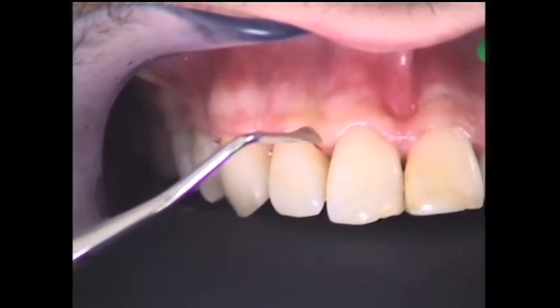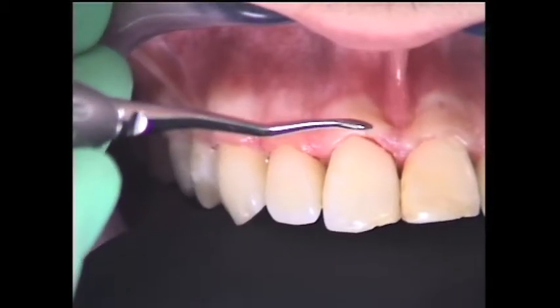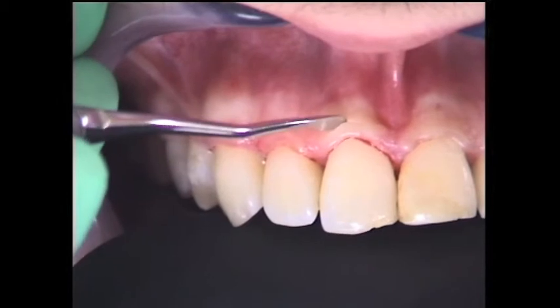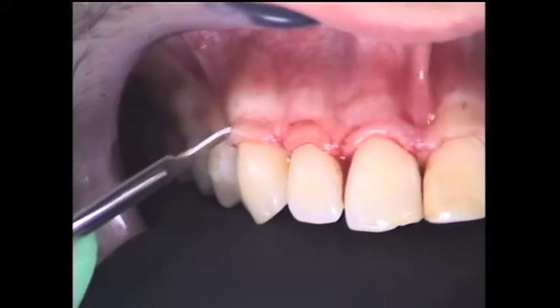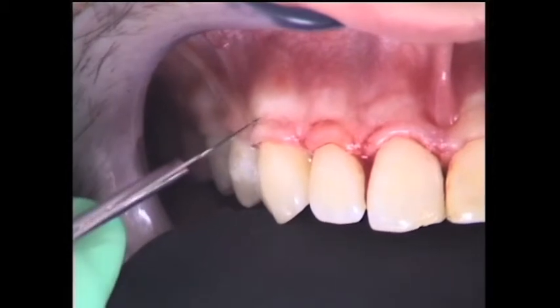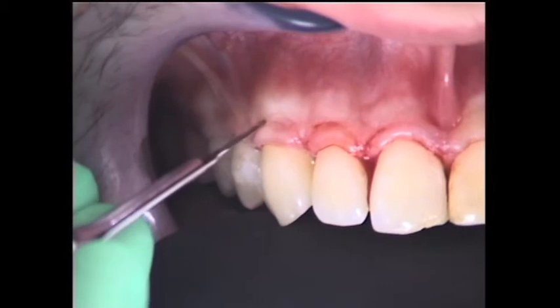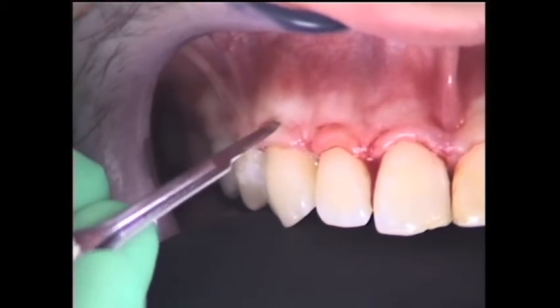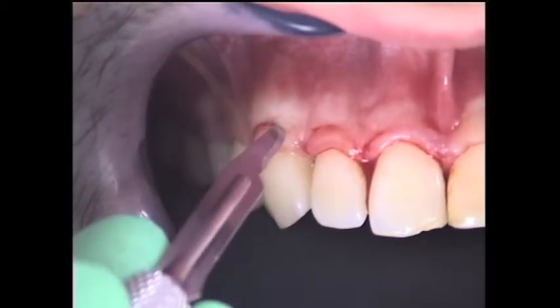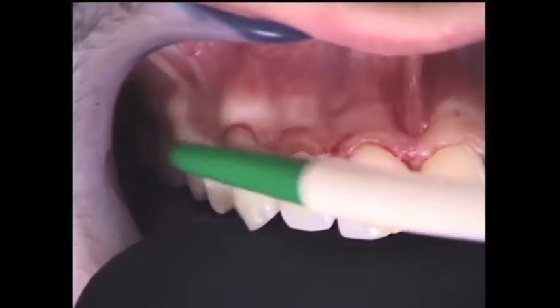Using a tunneling knife, we will actually design the flap, keeping in consideration the position of the CEJ of the teeth that we have evaluated in the X-ray. We perform an internal beveled incision with a 15C blade, keeping the blade as close as possible to the CEJ of the teeth.